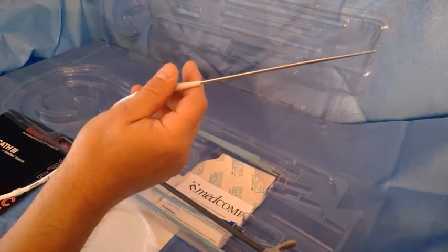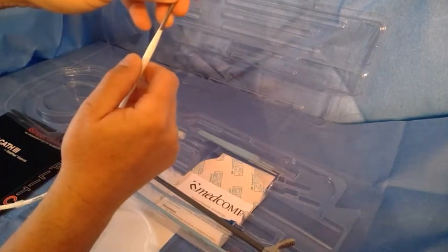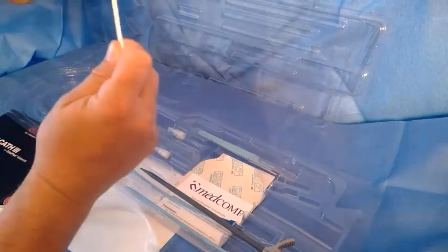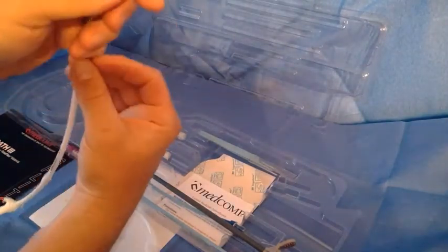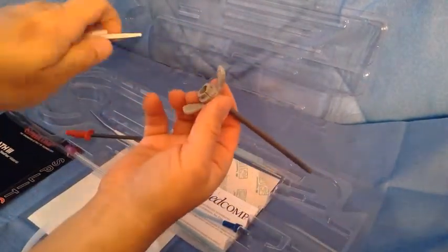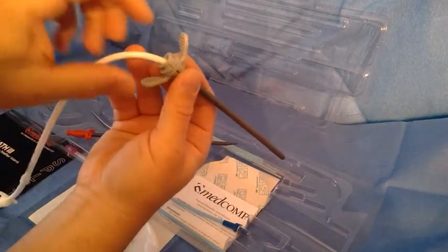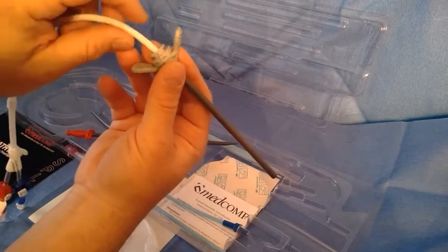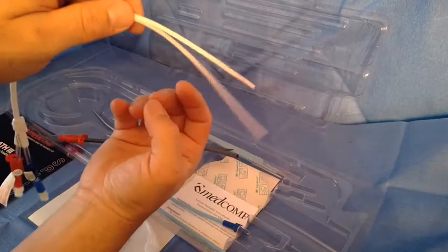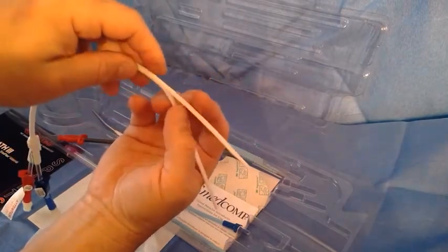We also sell translumbar trays. In this case, going through the chest wall up to the IJ venotomy site, you're going to pull the catheter through, take off the tunneler, and you'll have the base at the IJ. Go ahead and insert through the peel-away sheath — you don't have to hurry because it has a valve, so you don't have to worry about air embolus. Once this is in place, peel away the sheath, and inside you have two independent lumens floating around providing great dialysis treatments for your patient.